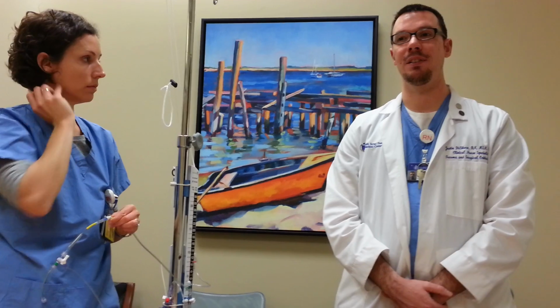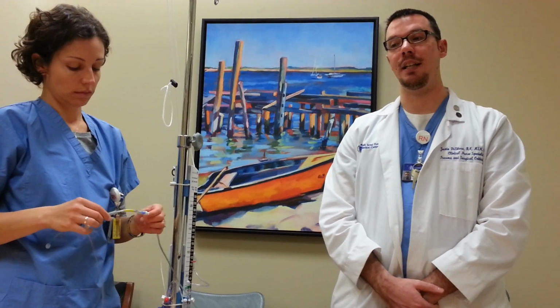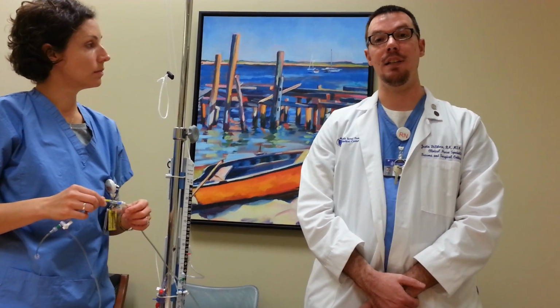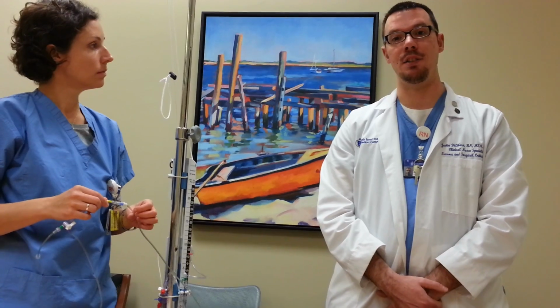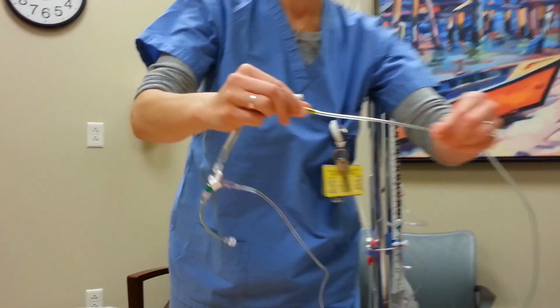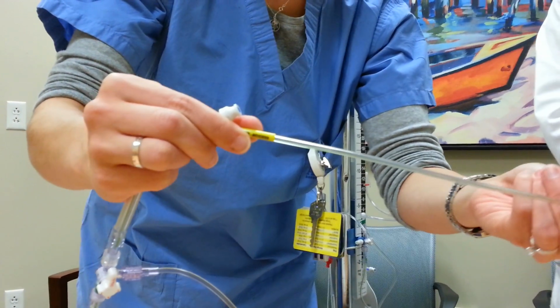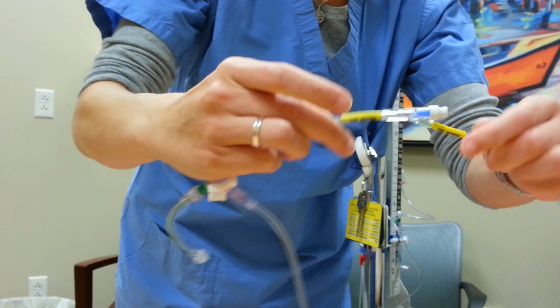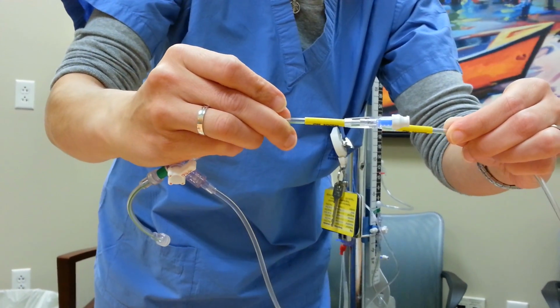And we're all going in multiple directions at a time. And inadvertently, she connected the IV infusion, it was vancomycin, to the EVD, and the patient did receive the infusion and died as a result. After that event, the company actually changed the tubing. So the EVD tubing itself has this green line in it to help identify that it's EVD tubing. Also, the draw port on either side has these yellow labels that are labeled as CSF.